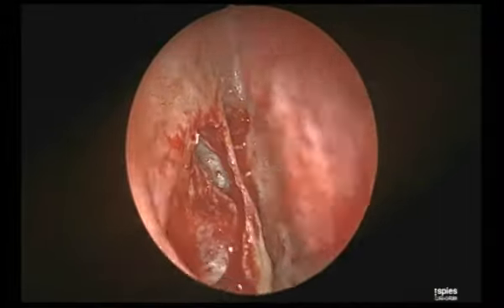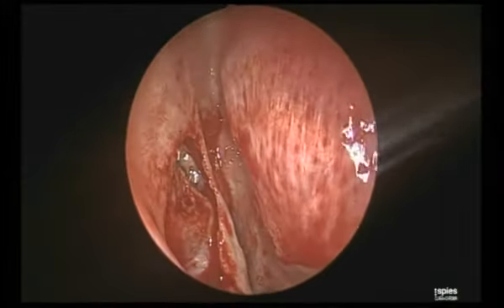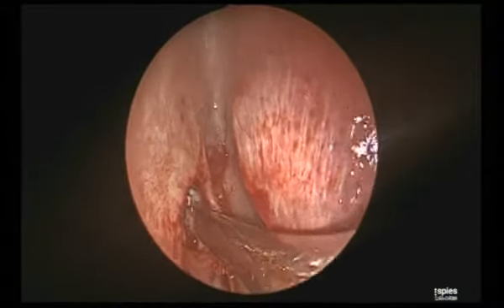See that? So what is up there? That is why there is havoc for the frontal sinus. If you have a proper landmark in view, now I will debride it.